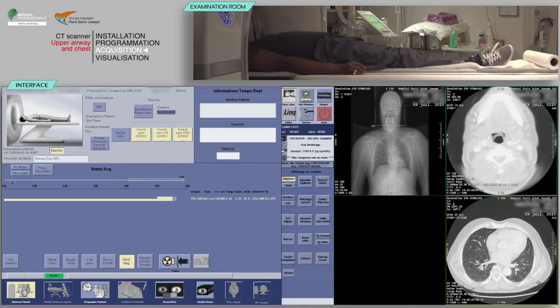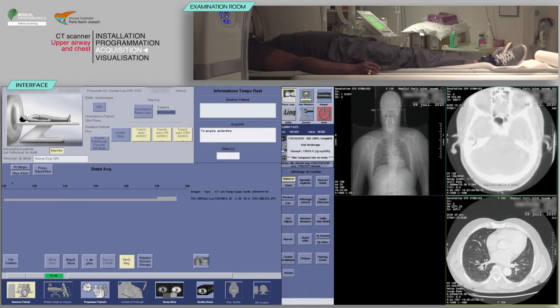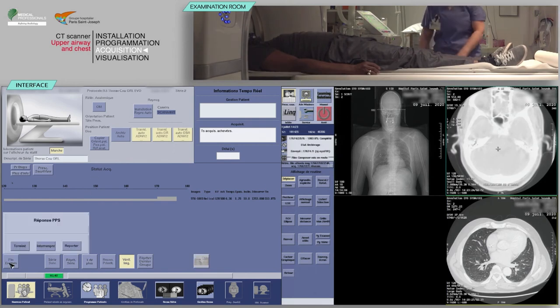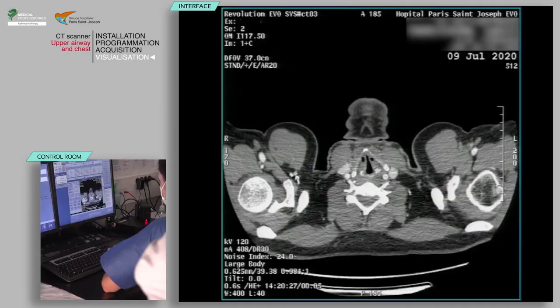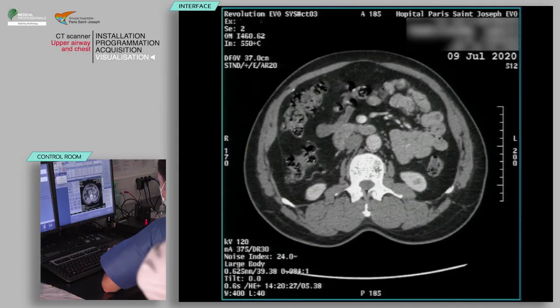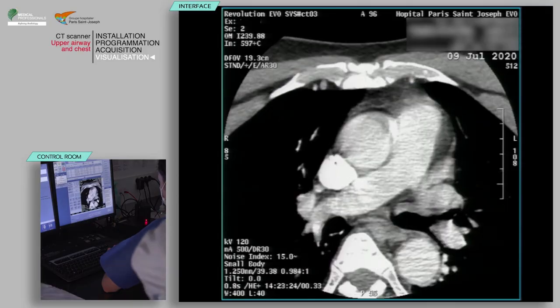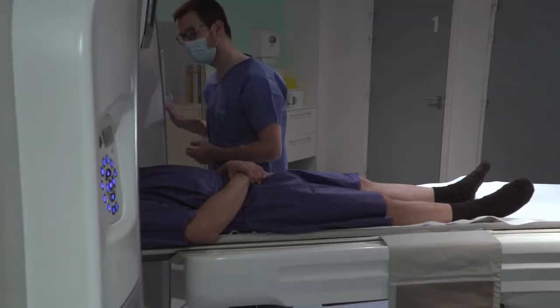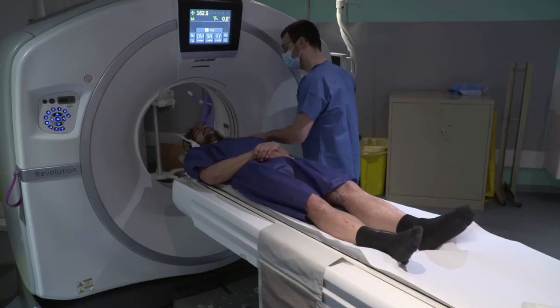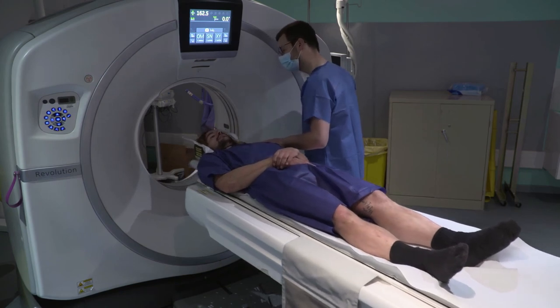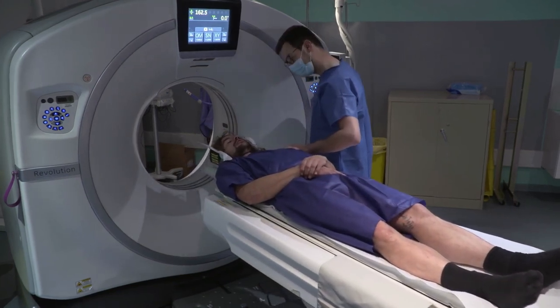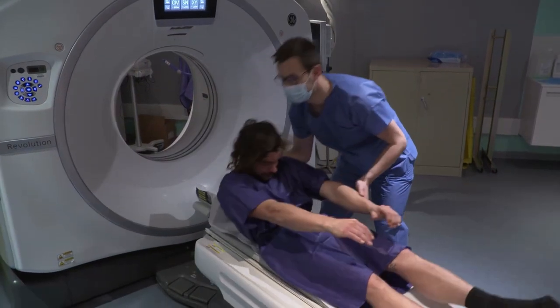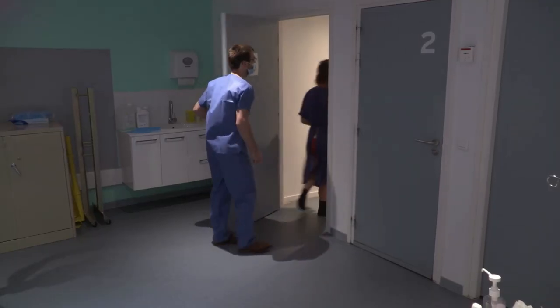Once the scan is complete, verify the absence of breathing or motion artifacts on the acquisition. Now you can click End Exam. You can also perform multi-planar reconstructions according to the requests of the radiologist. At the end of the examination, accompany the patient back to the changing room and tell them they can get dressed. Provide the patient with any post-examination instructions per your department protocol.